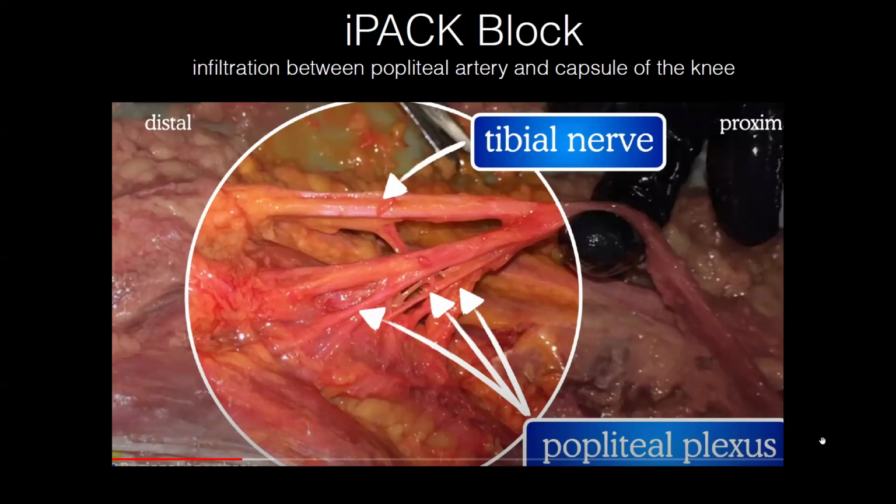That's why I'm always like, where's your needle? Where's your needle? Don't advance until I see your needle. You see me grab your hand, I'm like, wait, show me the needle. Don't be fishing around. First you find your needle and you follow your needle and you cannot cause harm. But if you get in there and then find your needle, you could be somewhere bad: intrathecal, intrapleural, intravascular.